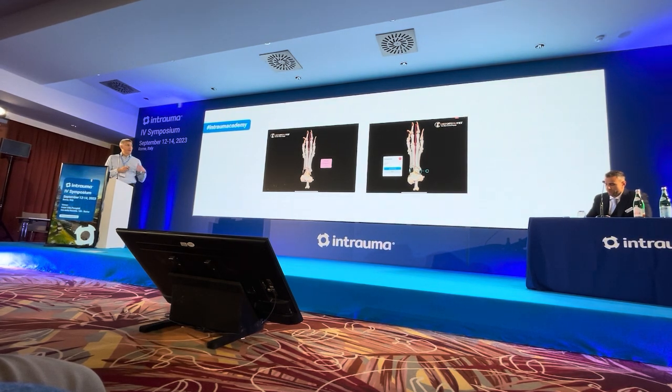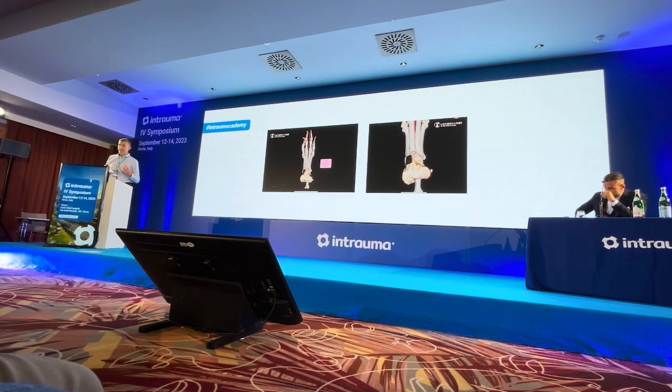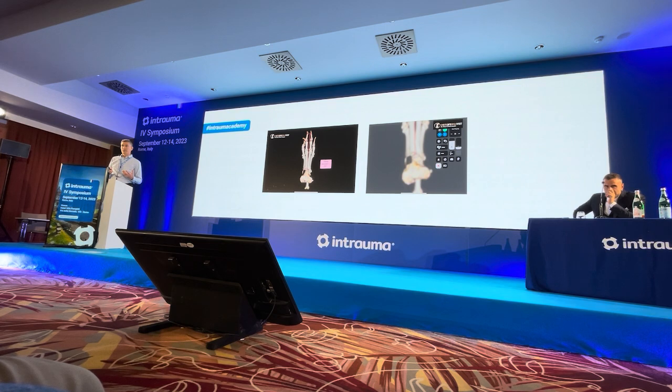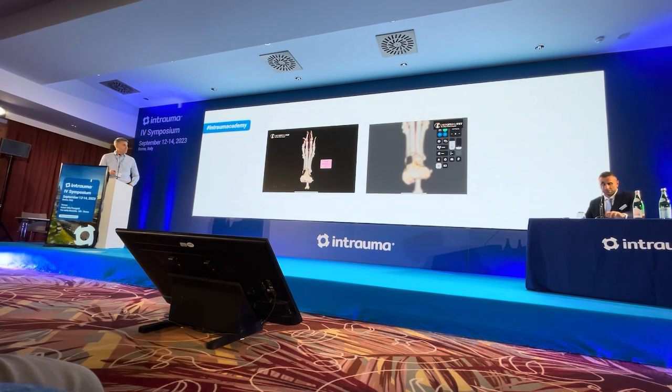This points out the treatment algorithm where TTTT is appropriate. I don't believe we have that final number, but I would argue that somewhere in the 15 to 20 degree torsion range is where we would apply this tool.